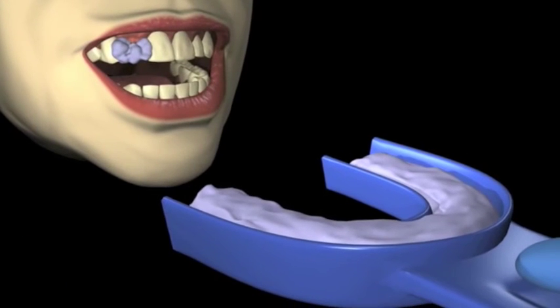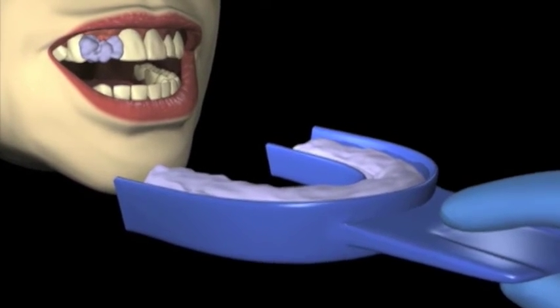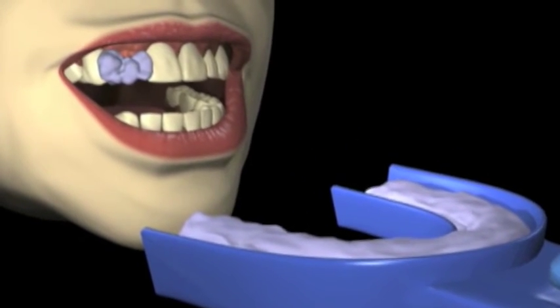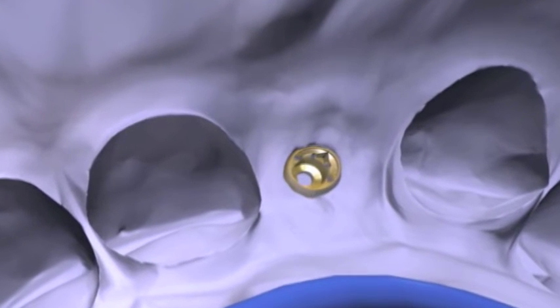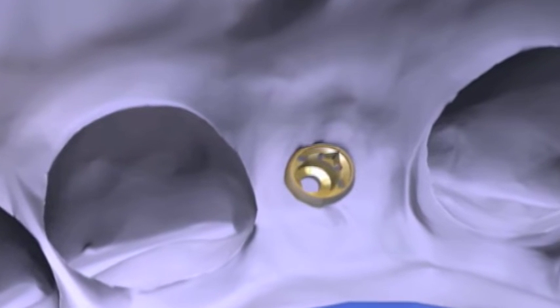A pre-formed custom tray is loaded, while syringe material is expressed over the pickup coping and adjacent teeth. A monophase impression material is appropriate for this procedure. The tray is placed and supported for the appropriate amount of time. The final impression is removed and inspected, and examination reveals that the coping has been firmly picked up in the impression.